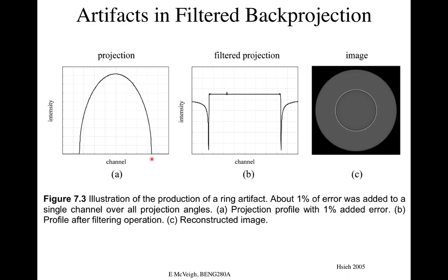So you can see why this whole set of detectors has to be essentially calibrated every day. You go through and look at the gain on those detectors every day, and before every scan if you can, and then you normalize your signal to the measurement of what the gain is on that detector at that time.